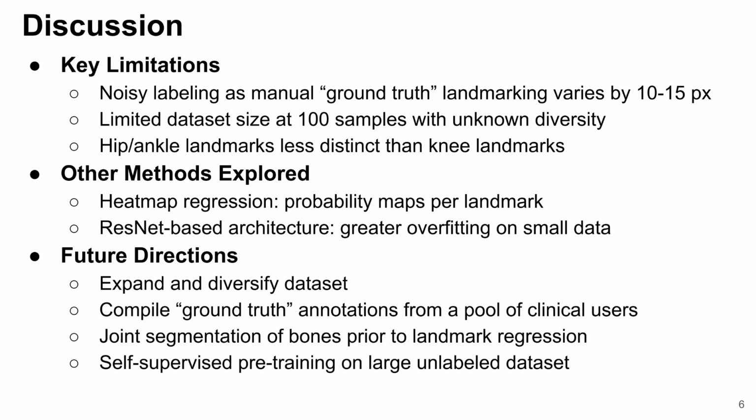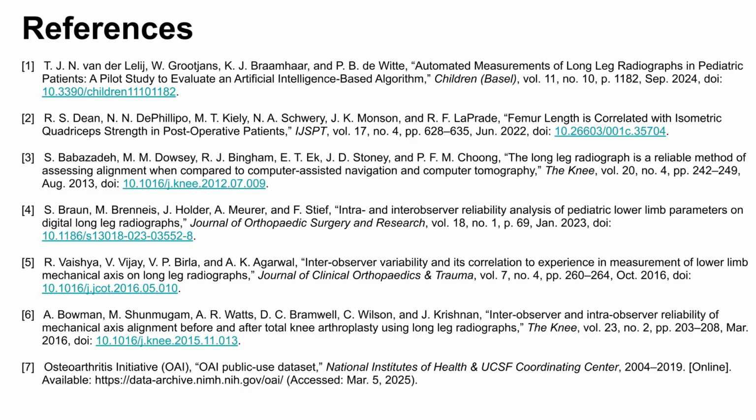In the long run, we envision combining landmark detection with bone segmentation and possibly predicting uncertainty as well. With those improvements, we believe this type of model could become a useful tool for radiographic workflows and improving diagnostic consistency. This concludes our presentation.